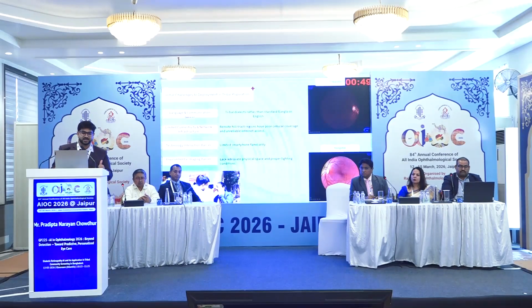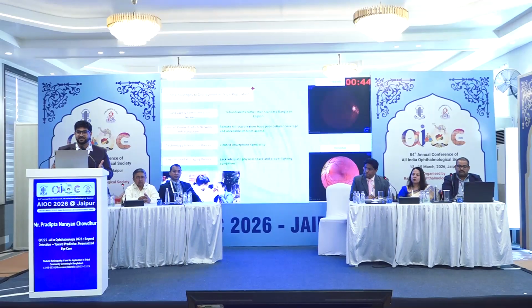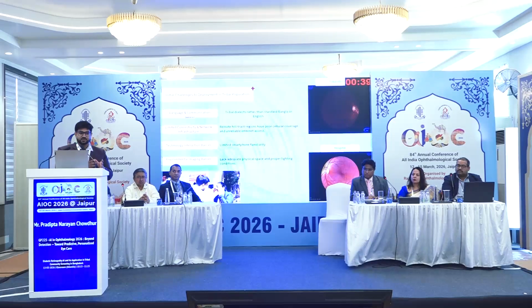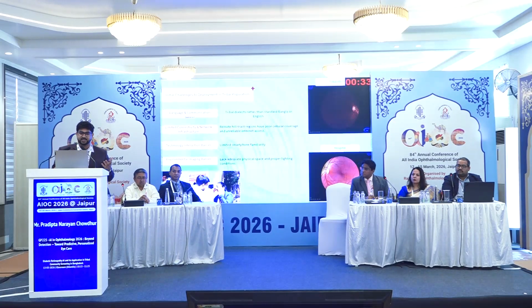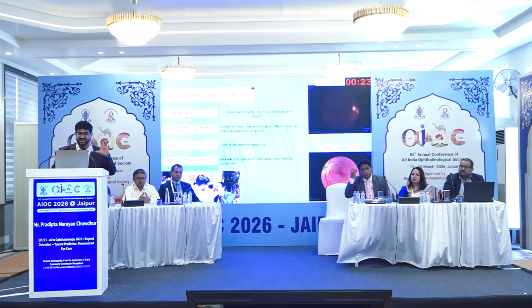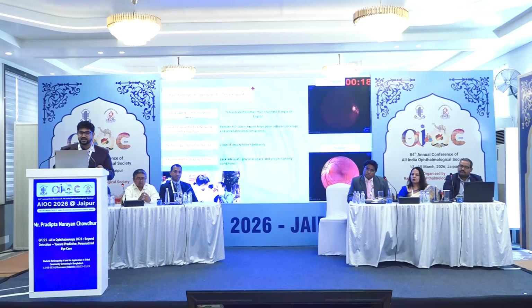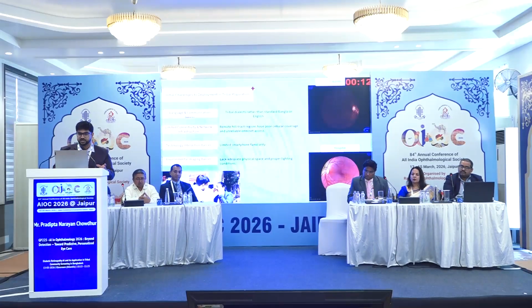And this is very tricky because sometimes when we go to the most remote corners of the hills, we don't even have a health complex. So we're just doing an open field screening. And we know all of our AI is dependent on the imaging quality that we receive. So because of sunlight or any other thing, or lack of illumination, you get bad images, so you get bad results sometimes. As you can see, that's me in a really sunlight heavy area. And in the tribal hill areas at the start, we saw that the illumination was very bad. But in the hospital, it was the same device and it was much clearer.